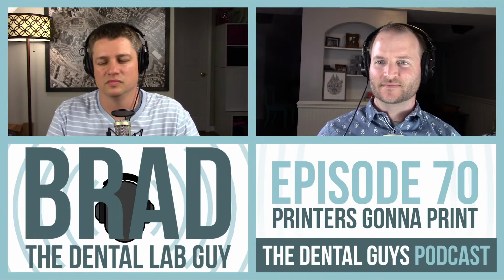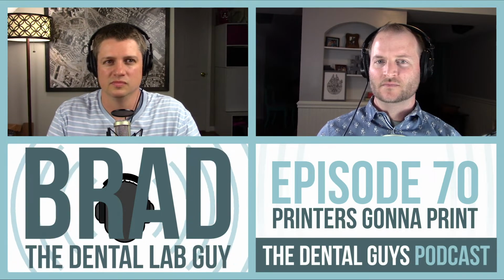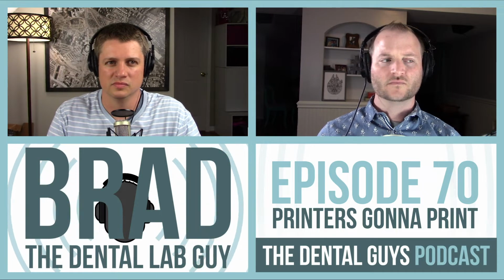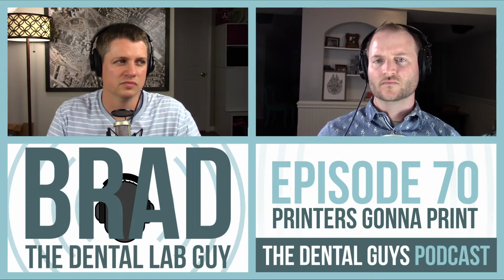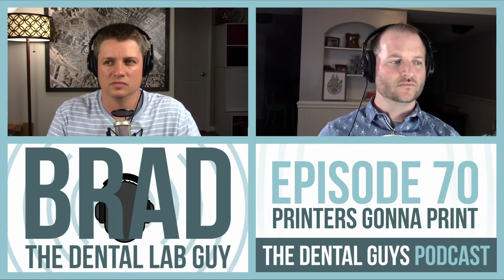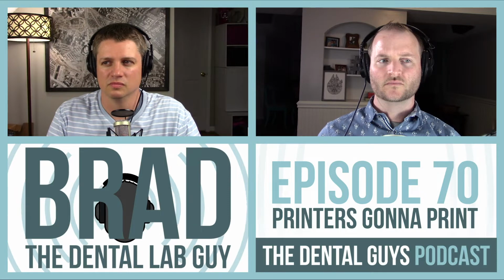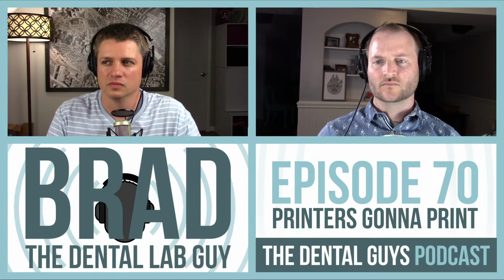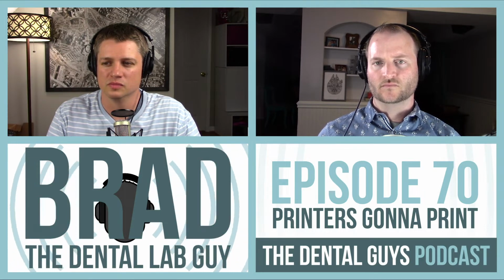It all has something to do with it, but the end result getting out of the printer is what you have to look at. So definitely, resolution, and there's different technologies that are out there too. You have laser technology, you have DLP type technology. Those are the most infiltrated into the dental business, those two types. Okay, so first you got to look at that. Then each one of those has their own resolution or pixel size of the camera, if you would. They have something to do with it also.